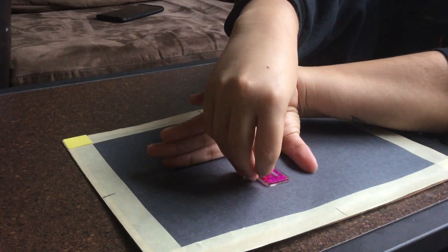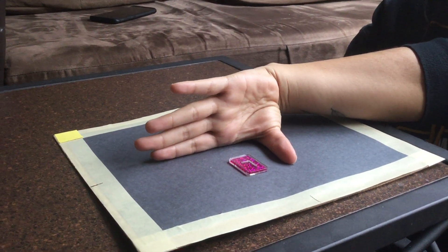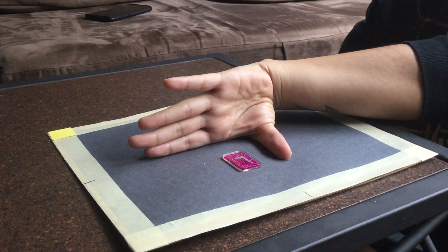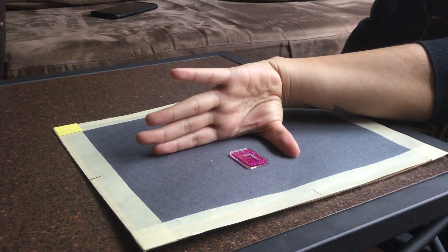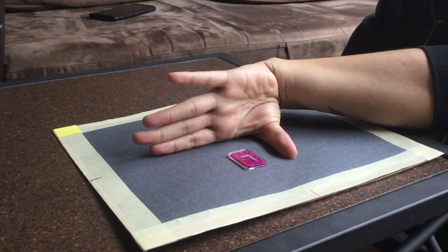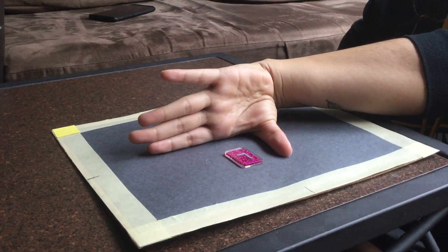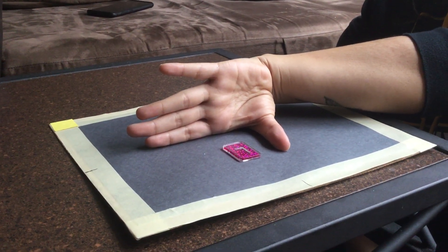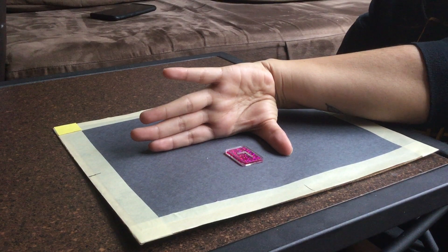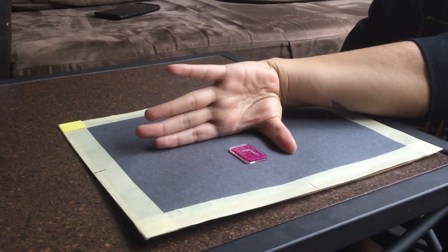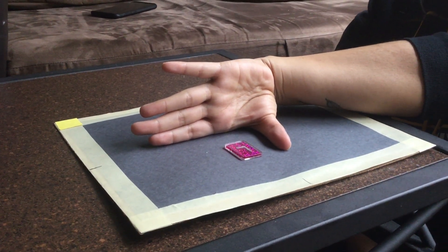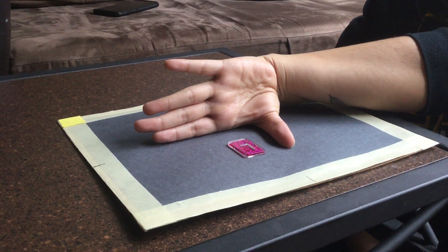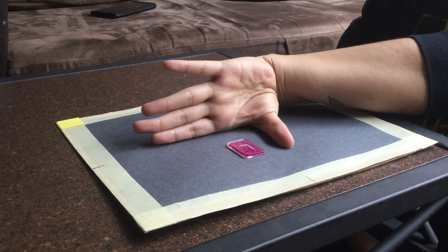The central ray is going to go perpendicular to the first metacarpophalangeal joint, and we're going to be collimating around the first metacarpophalangeal joint and the thumb, including the distal and proximal phalanges and articulations.